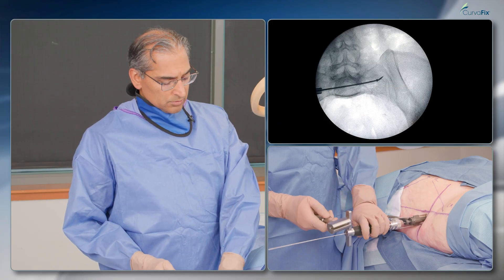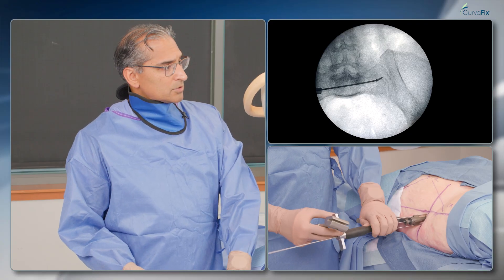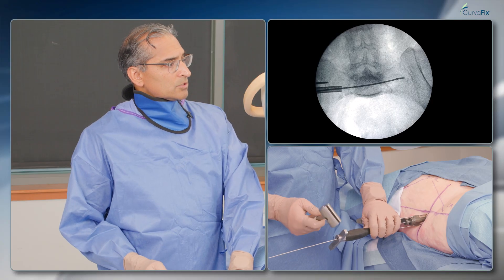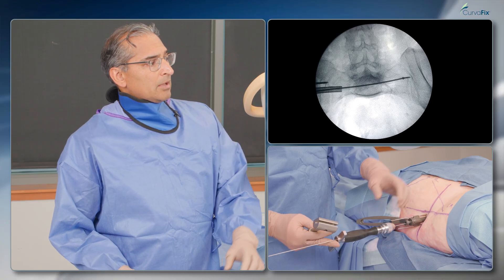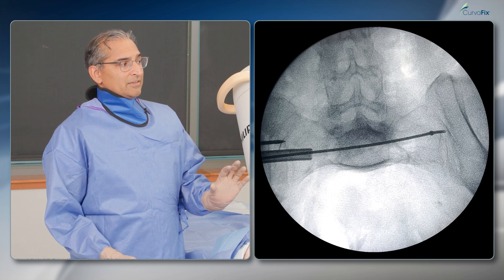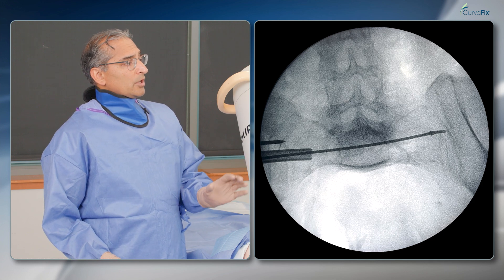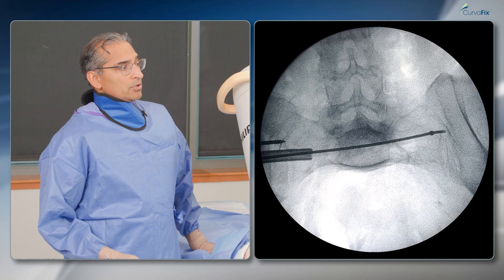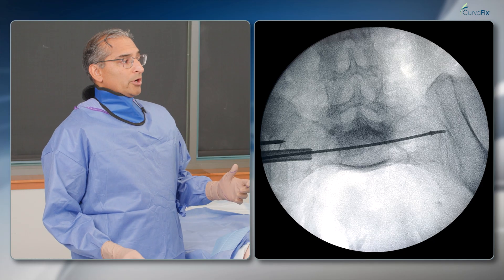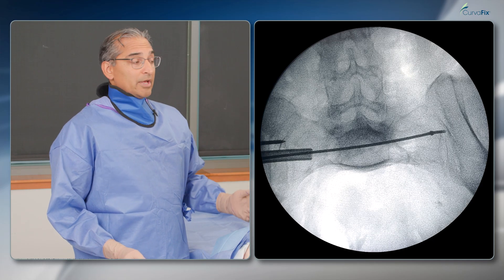Now I'm going to rotate that. I'm kind of stuck — I'm at the SI joint. The wire doesn't want to pass any further because it's a hard stop in good quality bone. So in this case, I'll use the drill wire. The drill wire will allow me to drill through hard bone, and then I can put my ball tip guide wire back in and navigate through that hard bone.